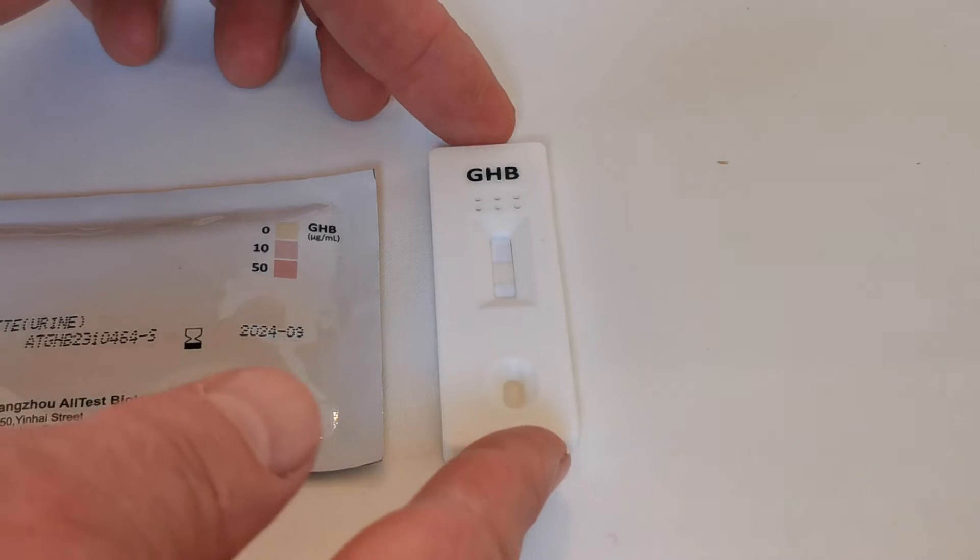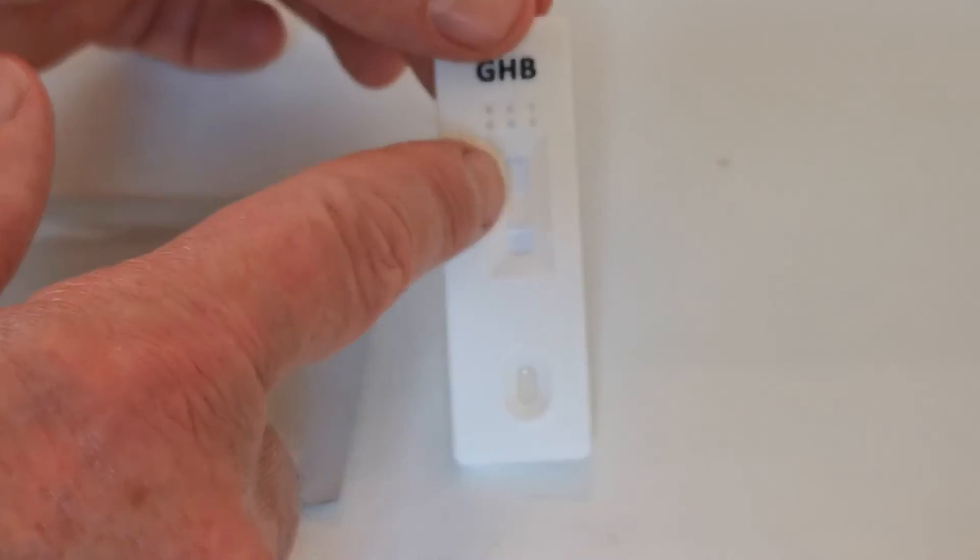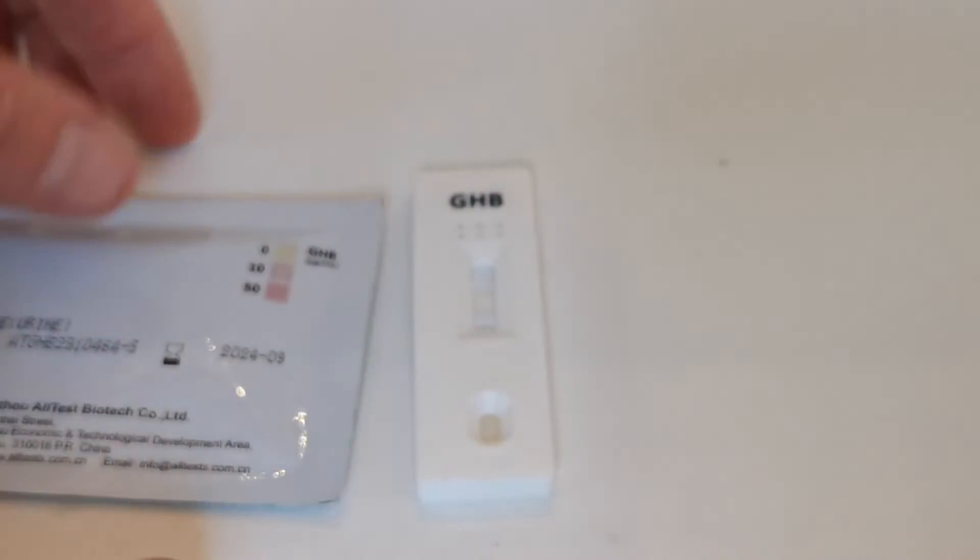You can see this is a negative sample, so there has been no color change on the central pad in the center of this test cassette.